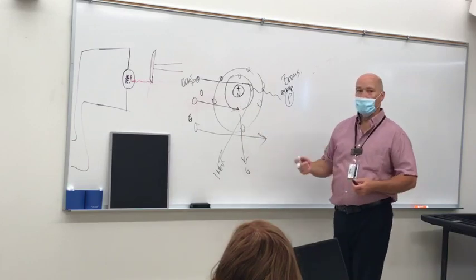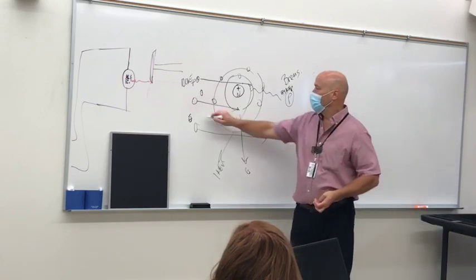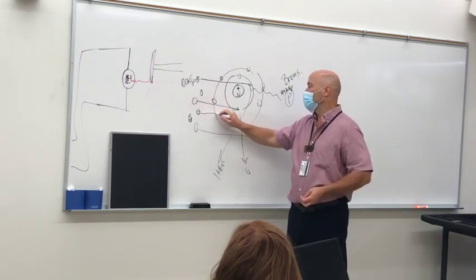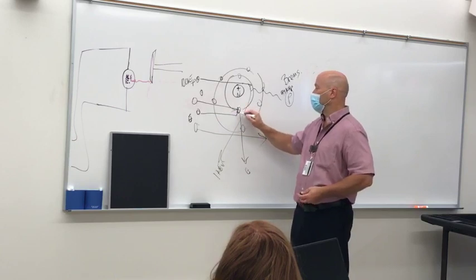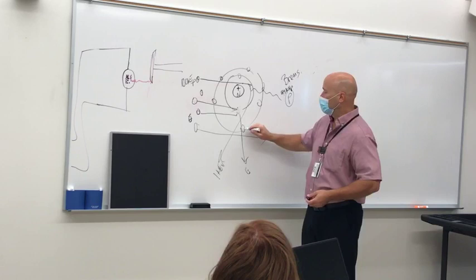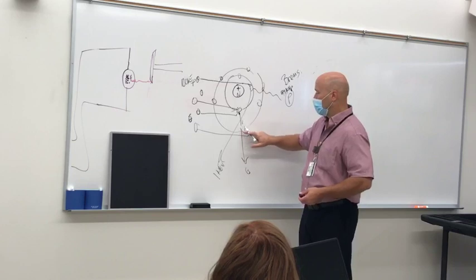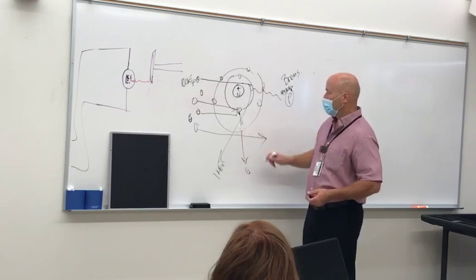It's an unnatural condition for this atom to be in. So it might snag another electron that's coming through and pop into place, and now it's happy again. If it doesn't do that, then it may take one of these electrons and pop it down into place. So you've got that again, but now we've got an unnatural condition here.